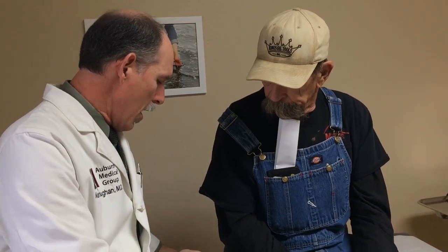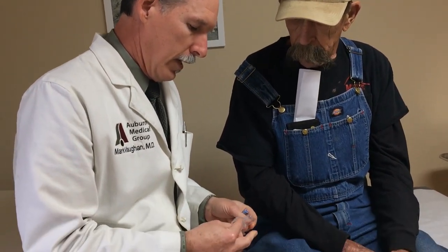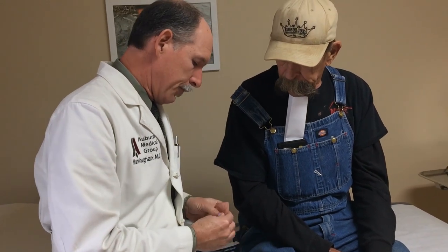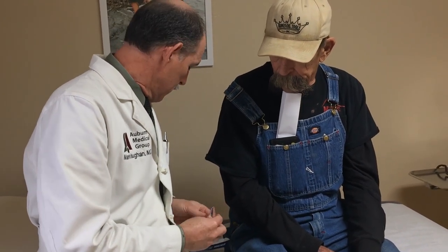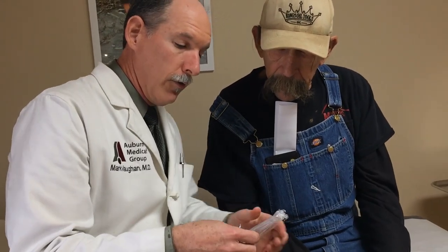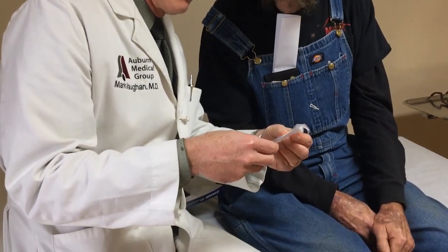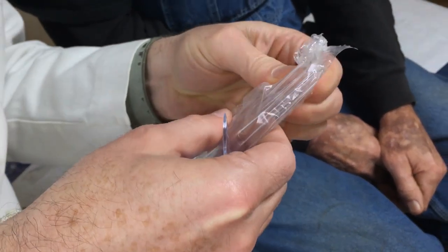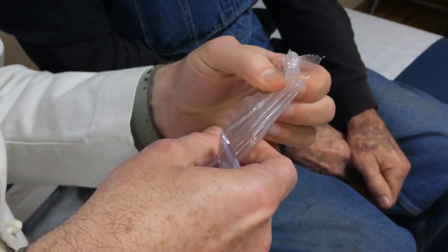Heck yeah, I'm happy to because it looks really cool. This one has a magnifying lens that goes on top of a light, so it lights up these different instruments for cleaning out ears. I can get one of these curettes in your ear and it lights up and then it's magnified. I want the biggest one I can get because you just have an absolutely plugged up ear there.